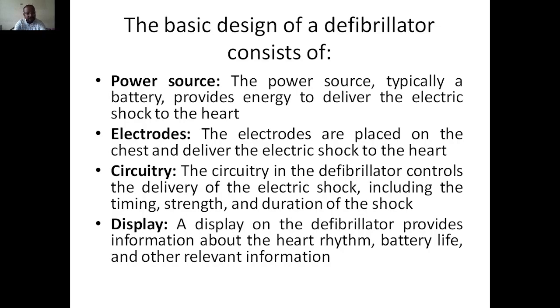Next, display. A display should be there that provides information about the heart rhythm, battery life, and other relevant information. After giving the shock, the display shows whether there is any change in the electrical activity of the heart. Also the battery life of the defibrillator, because giving a shock requires a huge amount of power supply.